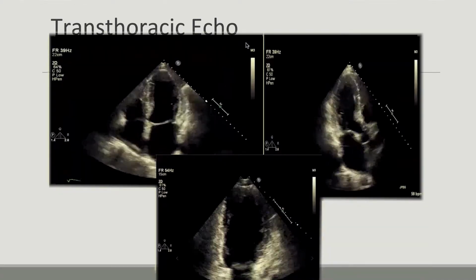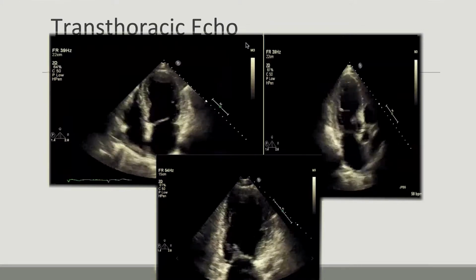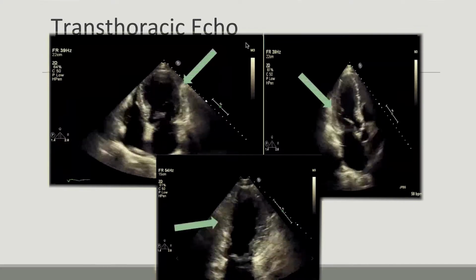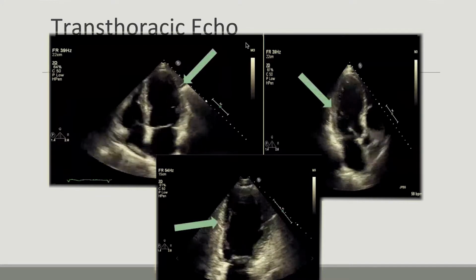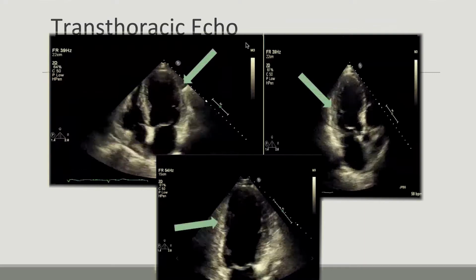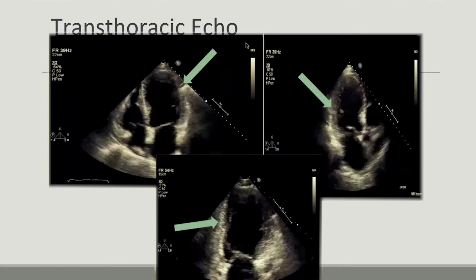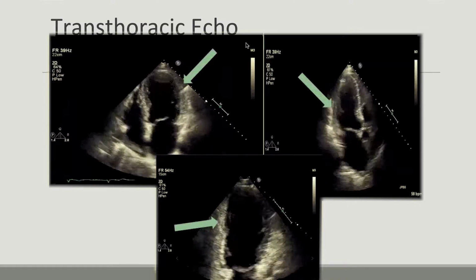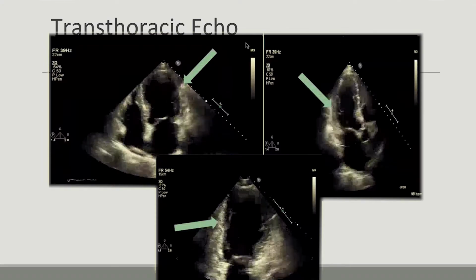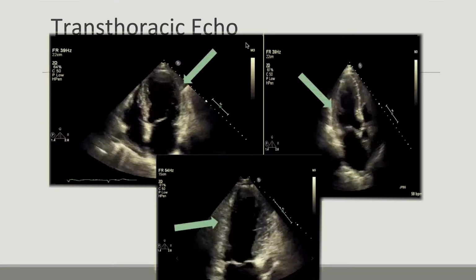In our apical images, we see the wall motion abnormalities more clearly that are the cause of this mitral regurgitation. We see scarring in RCA territory, which makes sense because that's where he had the most disease. Unfortunately, the stent put in did not revascularize the wall, so the defect is still causing the MR. In a lot of cases of ischemic heart disease, sonographers might consider using echo-enhancing agents to better define the regional wall motion abnormalities. Although it really helps to define the endocardial border, those agents do not help with looking at valvular pathology.